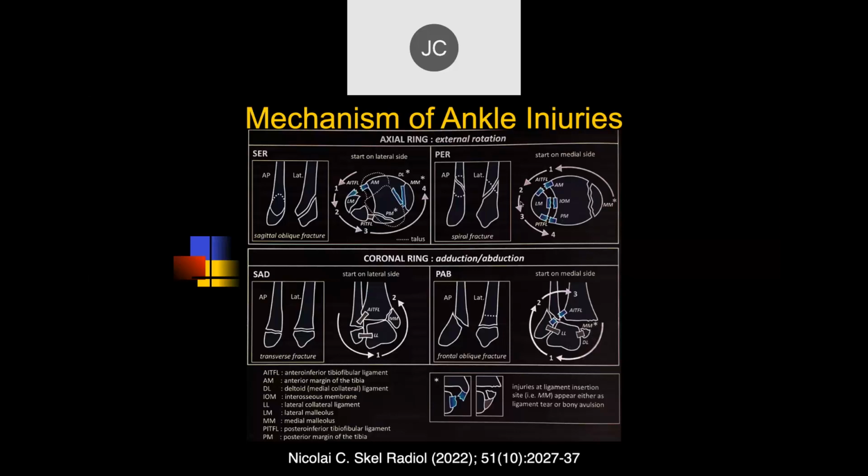So these are the four classic type injuries that often the surgeon would like to know concerning mechanism of injuries, because it helps them anticipate where the injury is going to be. With MR, we can directly look at the location of the different injuries. I fall a little bit short.